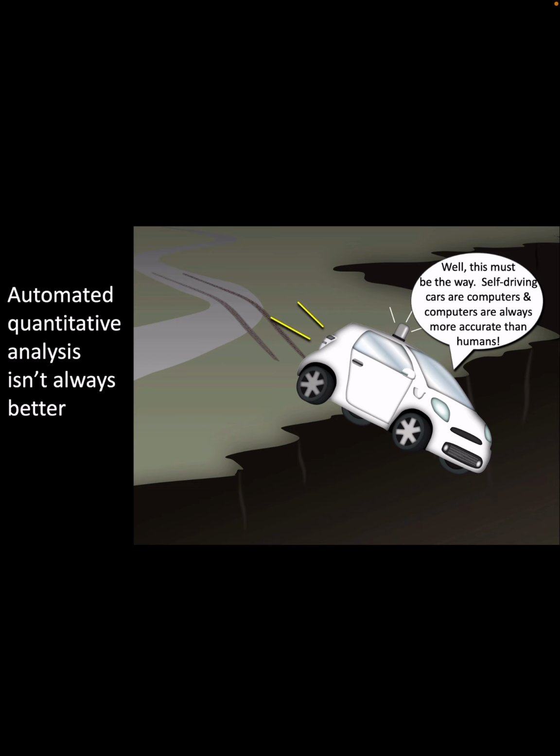There can be segmentation errors in the software that affect the analysis. When you have such a small volume as the hippocampus and entorhinal cortex, even very small errors in segmentation that cause small errors in volume analysis can actually make a huge difference in the percentiles that you see.